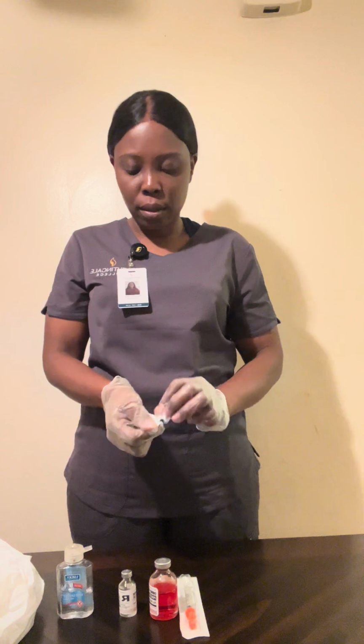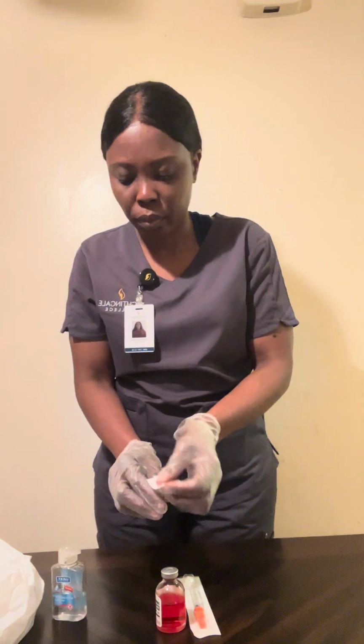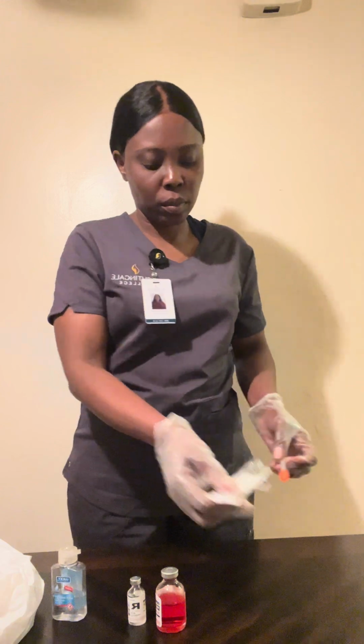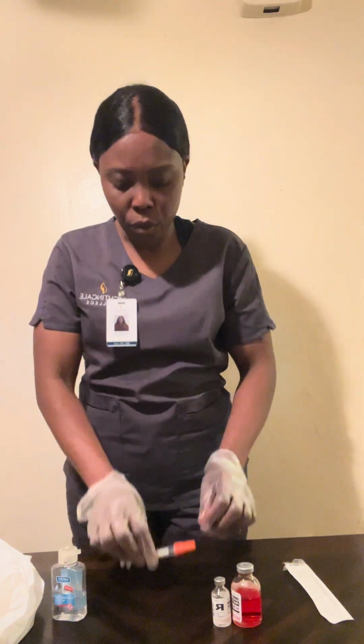Okay, Mr. Smith. Before I begin, I'm going to make sure the insulin is nice and clear, because the NPH is cloudy by nature. Now I'm going to use an alcohol prep to clean the top of each vial. Now this is my 1 ml syringe. I have my 1 ml syringe, and I'm going to uncap it carefully.